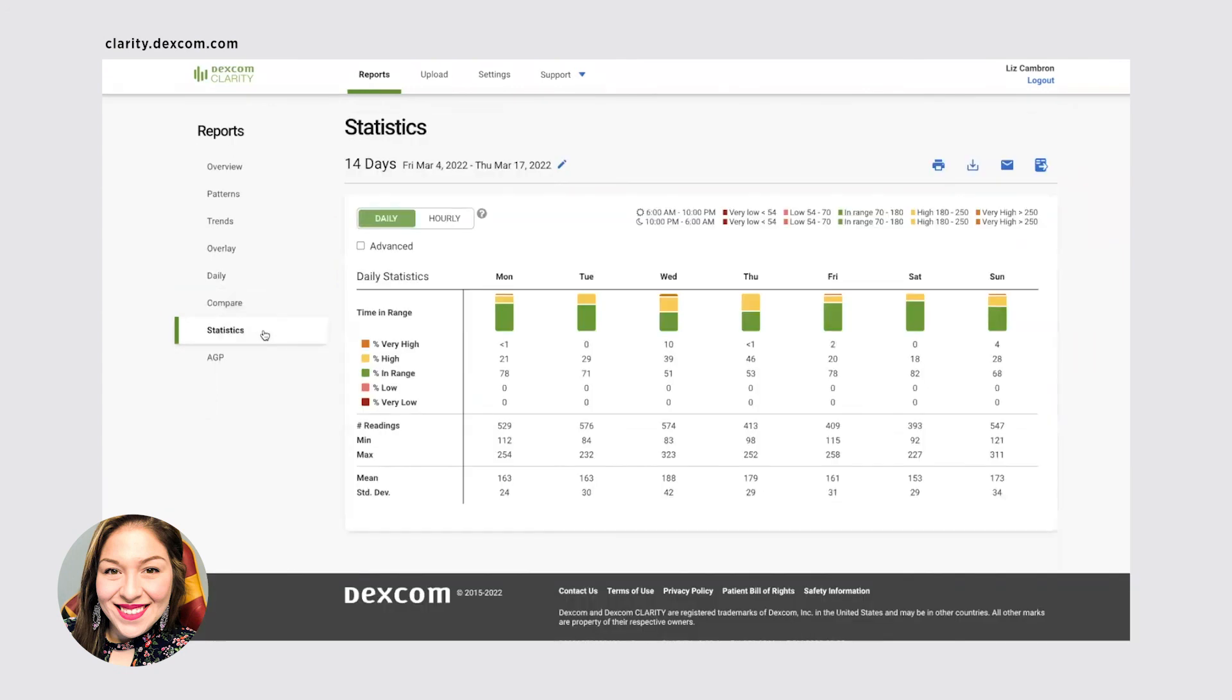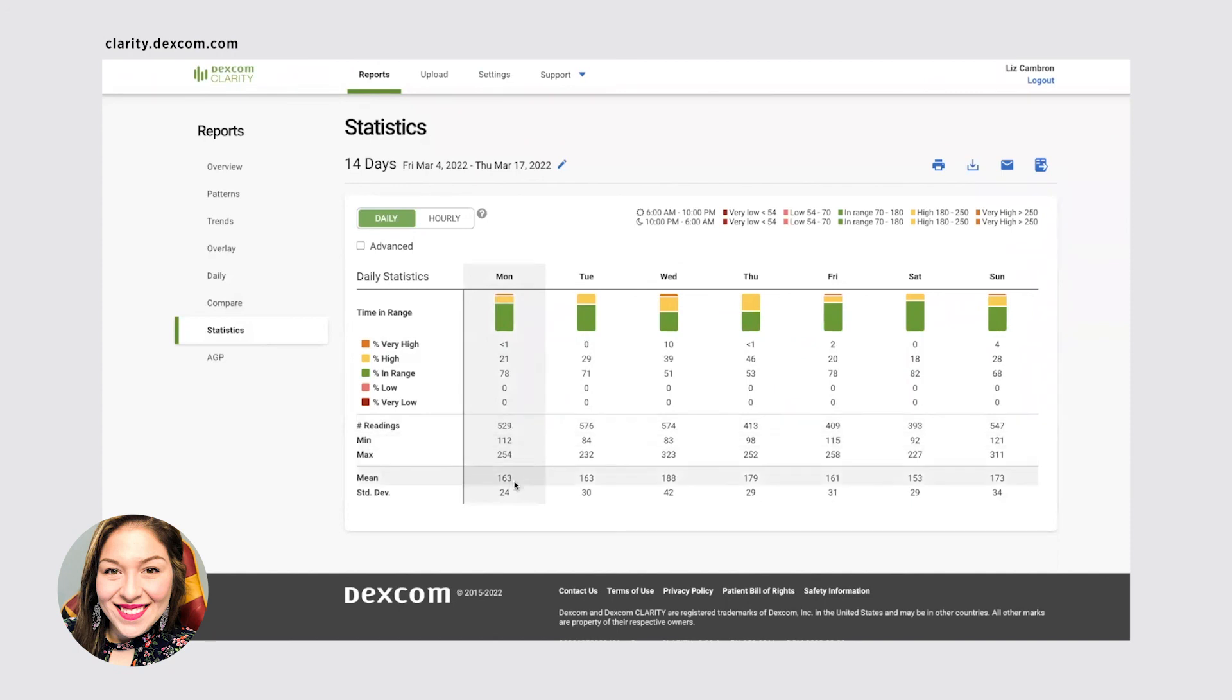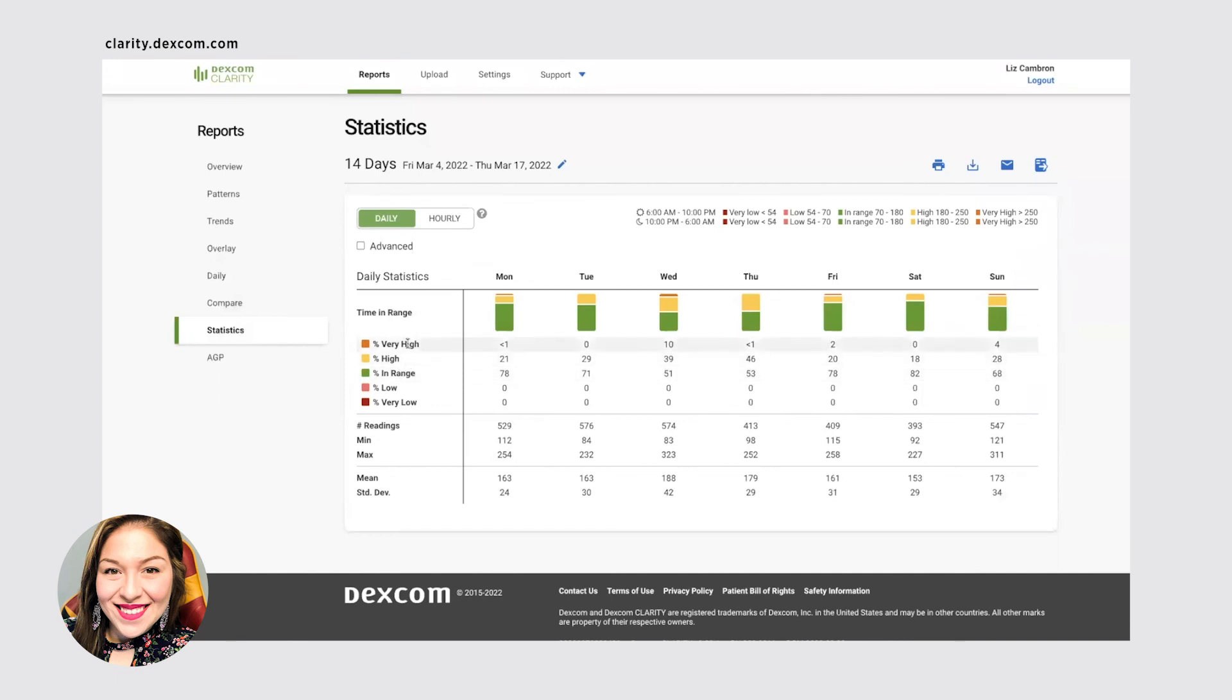Statistics. If you're really interested, you can see the exact numbers of how many readings you got, what your mean glucose, your average glucose was. And then the bars show you that time in range. So green is time in range. Yellow is high. It shows you here. Red is very high. And then you have low and very low.